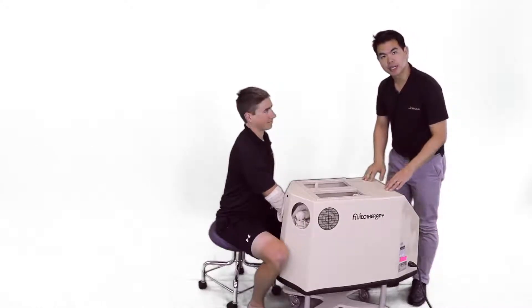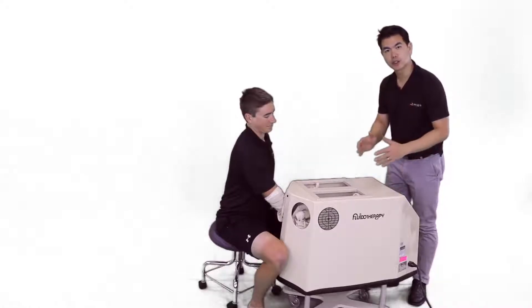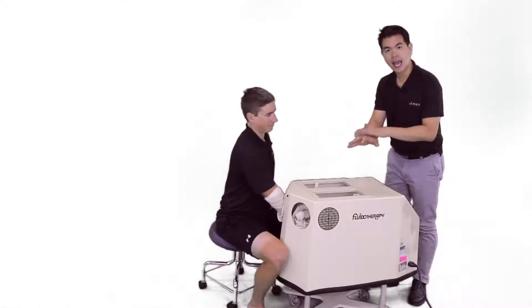The treatment will last for 20 minutes, and then we'll conclude the treatment by checking on the patient's skin and temperature.